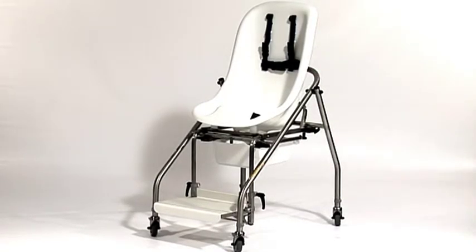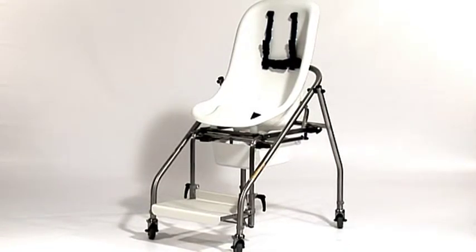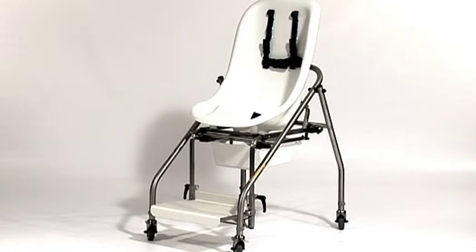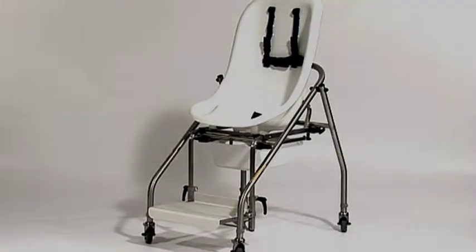The Chaley seat is an innovative design, born from a special partnership with Chaley Heritage Clinical Services. Through consultation with Chaley's clinical specialists, the seat has been designed to provide an improved and functionally correct posture.